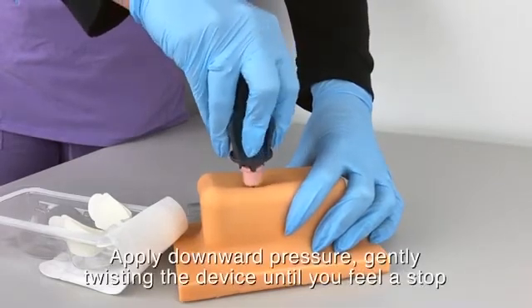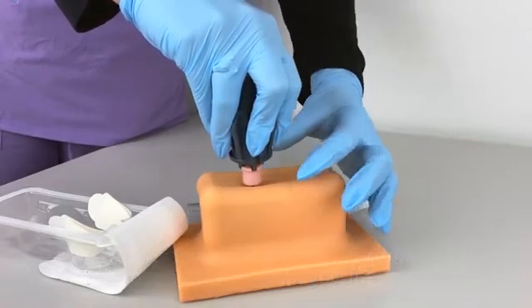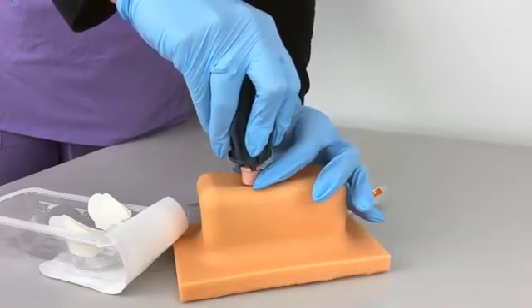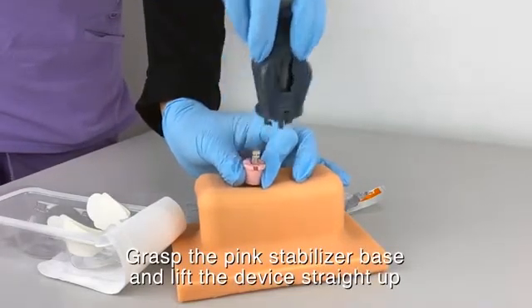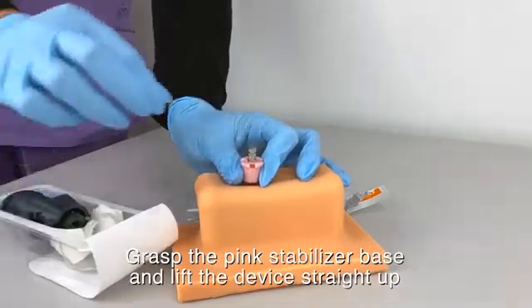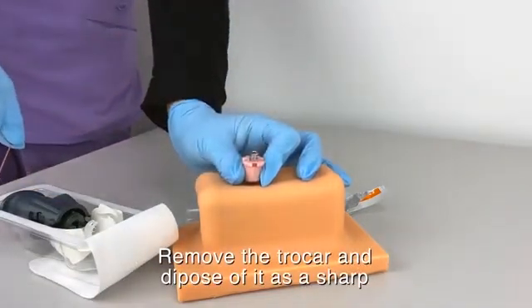Once you feel bone, gently twist back and forth until you feel a stop — you have now entered the cortex of the bone. Grasp the pink stabilizer and pull the casing straight off. Remove the trocar and place it in the sharps bin.